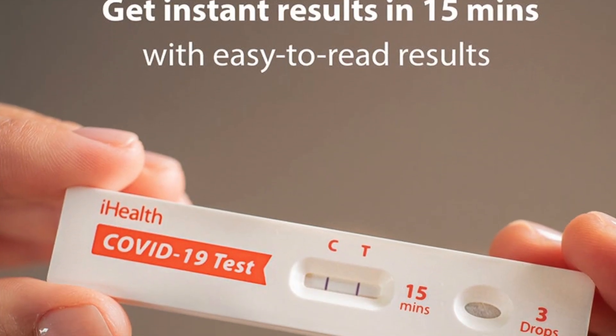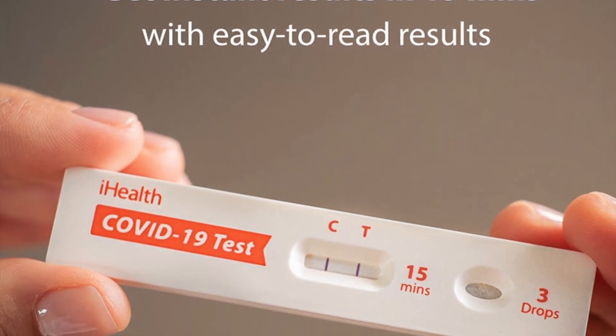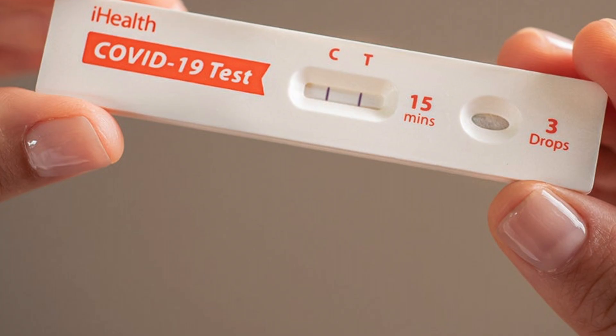Once the 15 minutes is up, read the results. There are two lines to look for: a test line and a control line — the T and the C. C means control, which just tests that the kit is working properly. If you see a line appear under the T, that means you have a positive test. Here you can see there is a line under the C but no line under the T, which means I am negative. If you get both lines — both the C and the T — the test is positive.